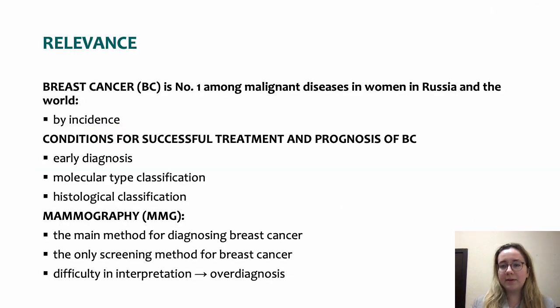Mammography is one of the diagnostic methods as well as the only screening method for breast cancer. Mammography as a diagnostic test is difficult to interpret and often leads to overdiagnosis. This is especially often observed against the background of dense mammographic glands, which requires additional diagnostic examination by ultrasound diagnostic. The international BI-RADS scale is used to standardize mammography results.